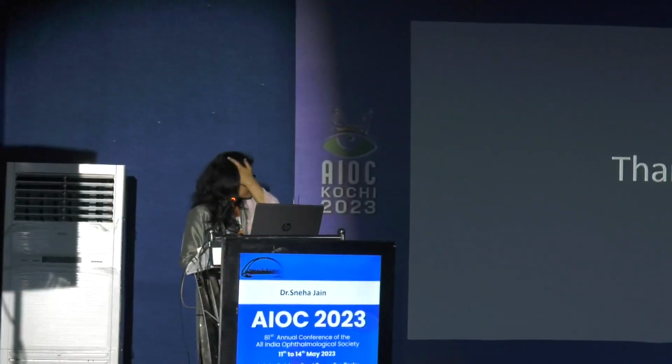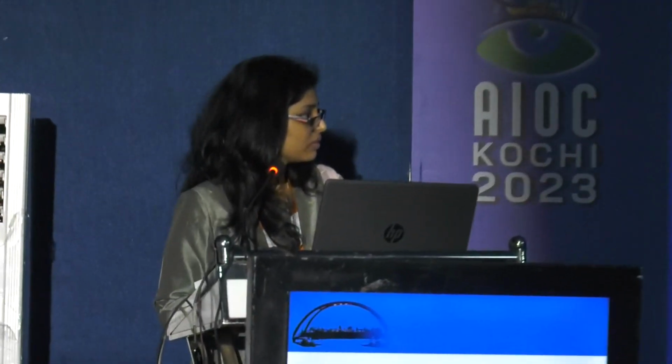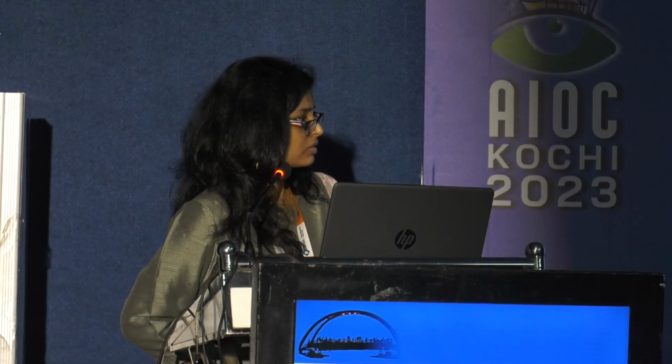Beautiful presentation, Sneha. One thing I really liked is that you had a very low threshold for bimanual removal of the subretinal membrane. In these situations, many a times the retinal break, or the retinotomy created for removing the subretinal band, usually expands. So it's a good way to do a handshake sort of technique.